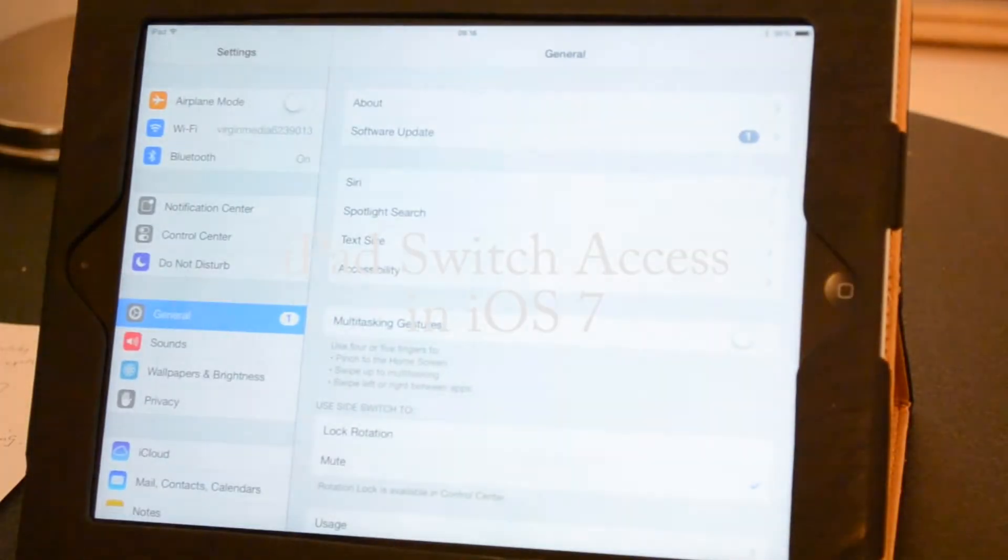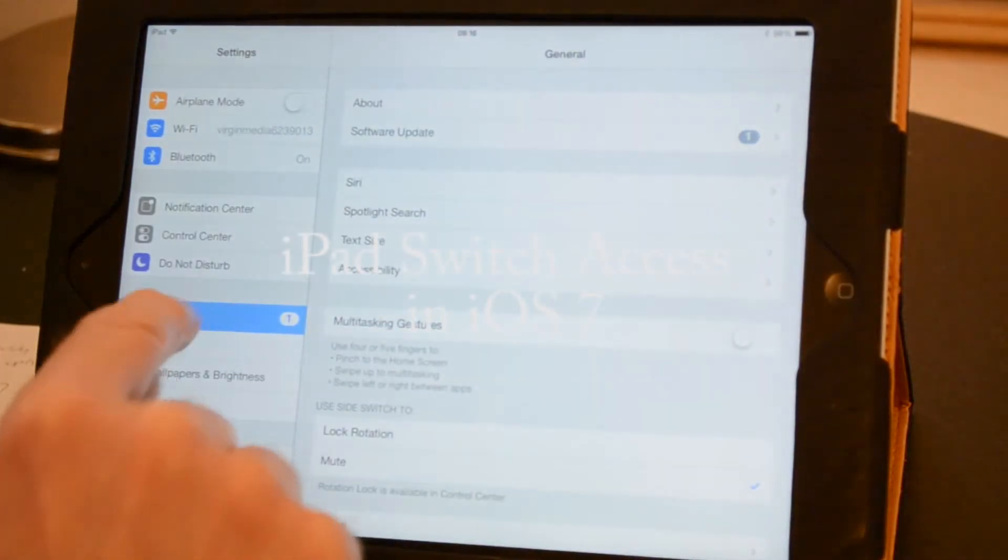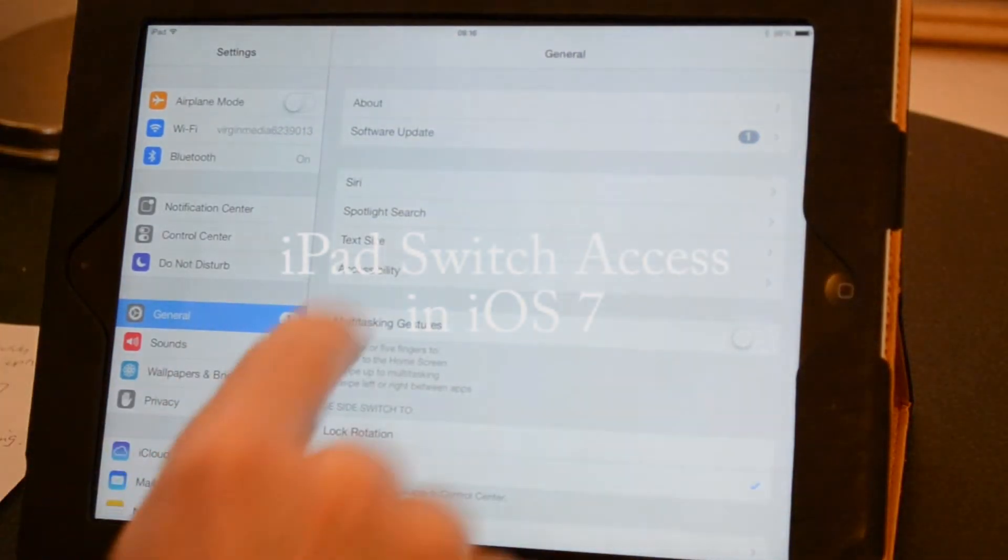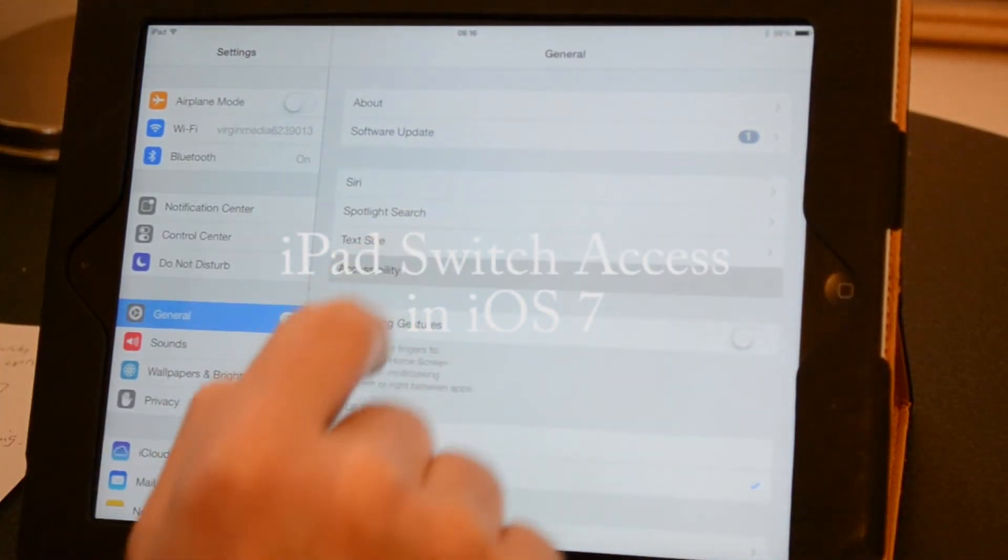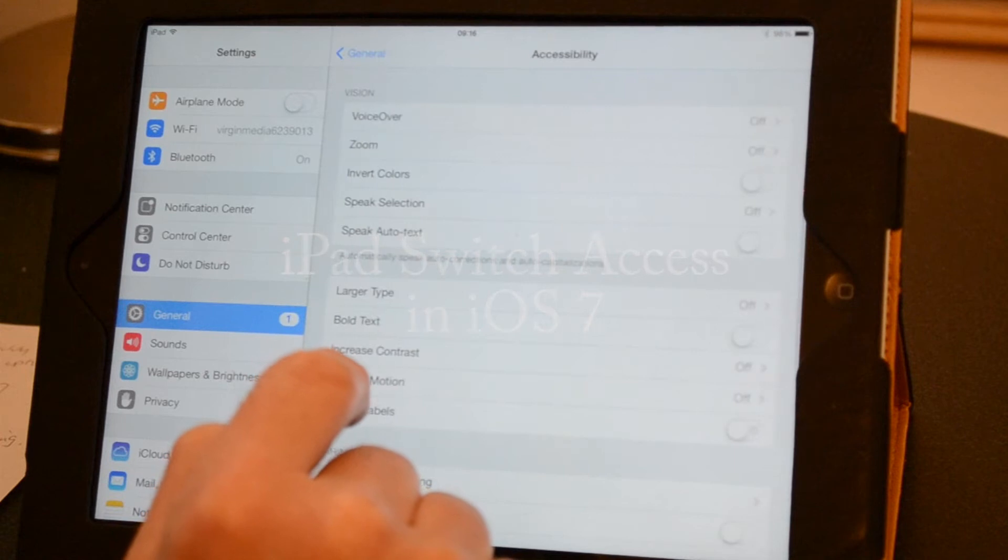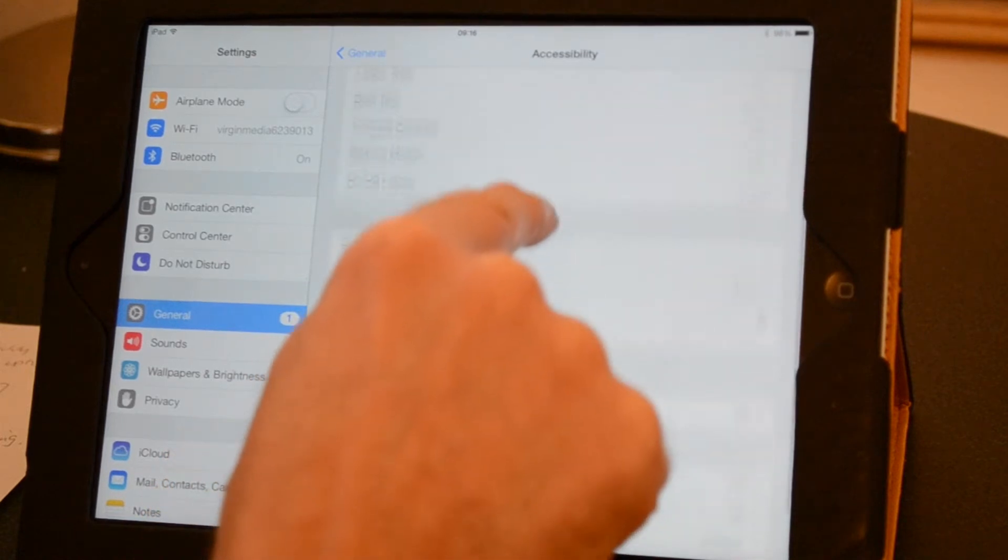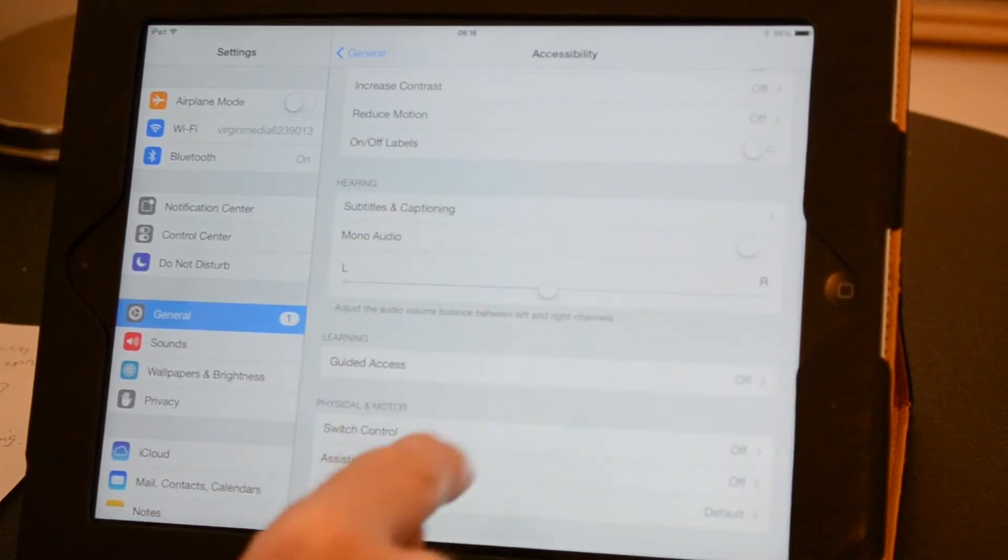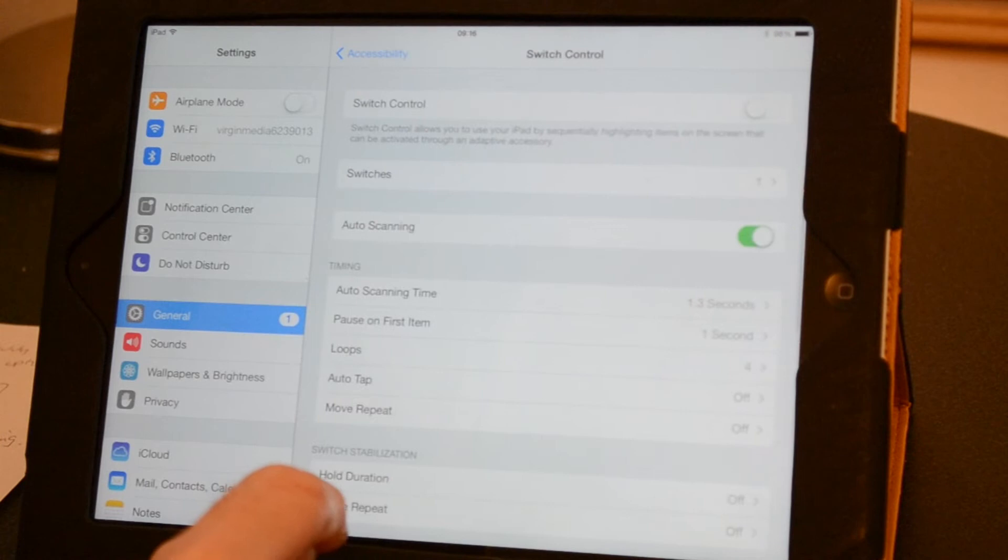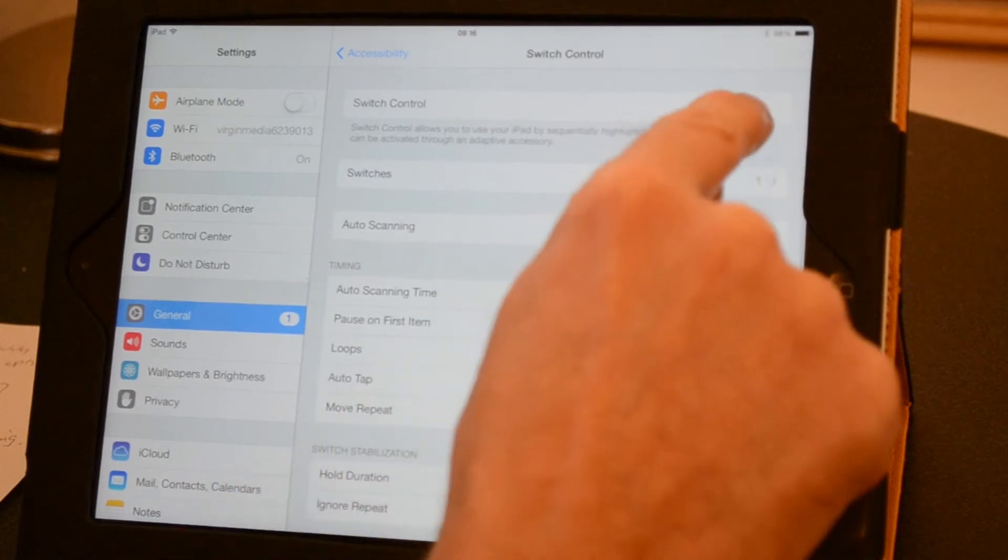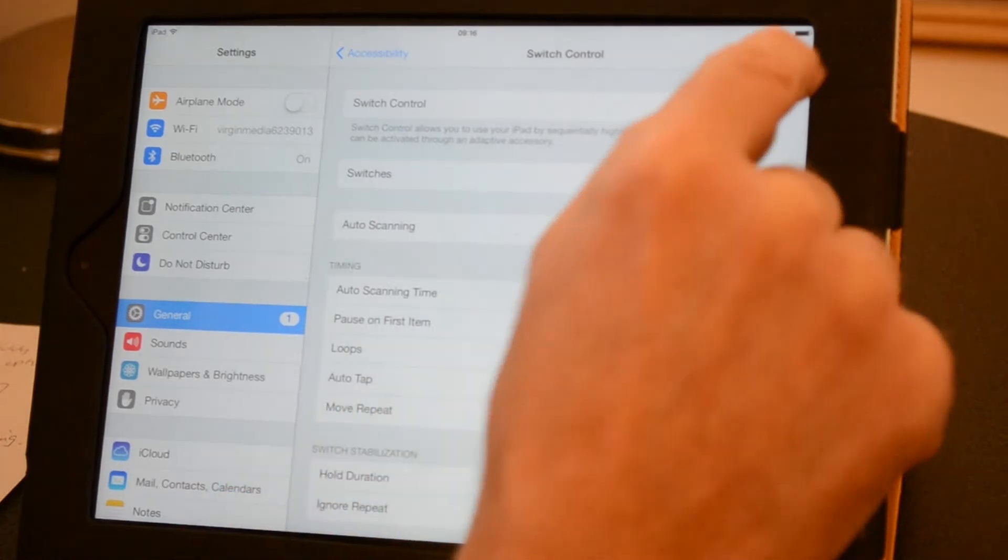iOS 7 includes some improved accessibility features for the iPad including some switch control options. These can be found in the settings menu under the general tab.